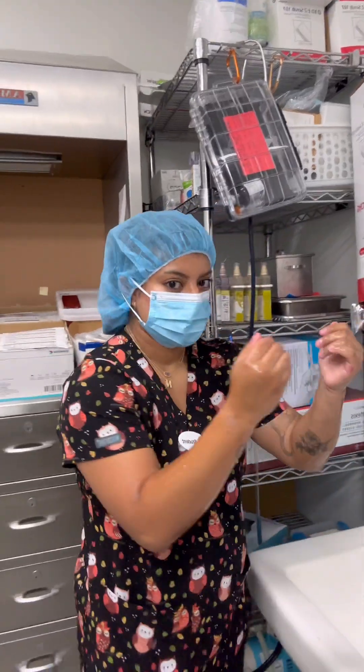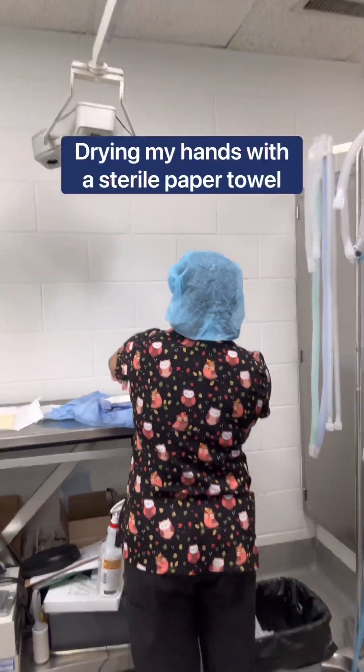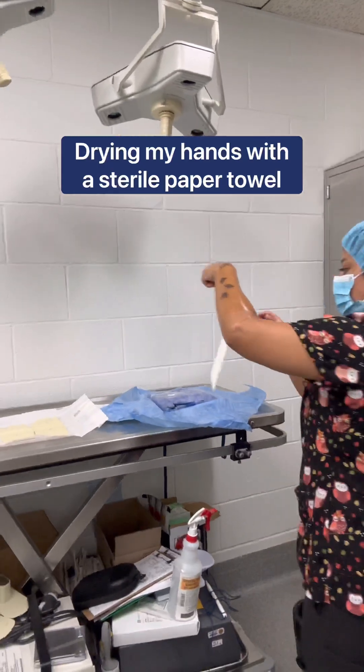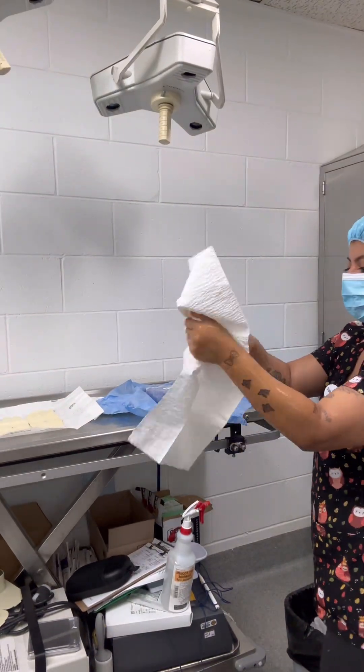Now we're going to go around over here and go ahead and use that sterile paper towel to dry off your hand. Just drop it right in the chair.